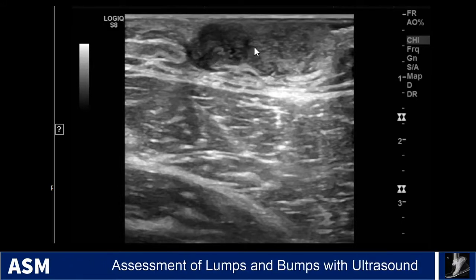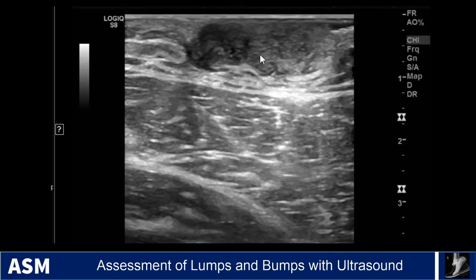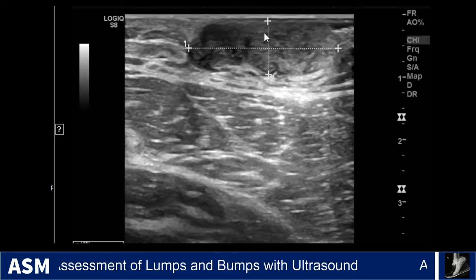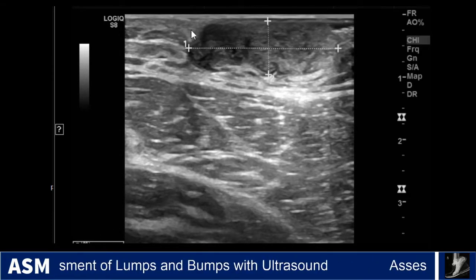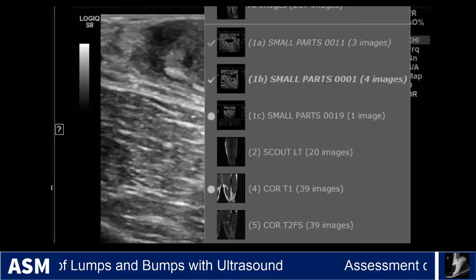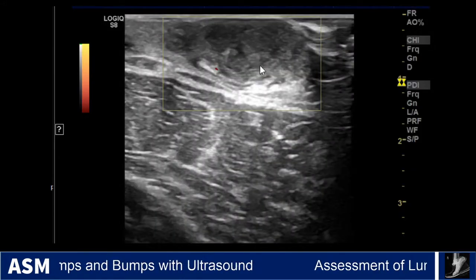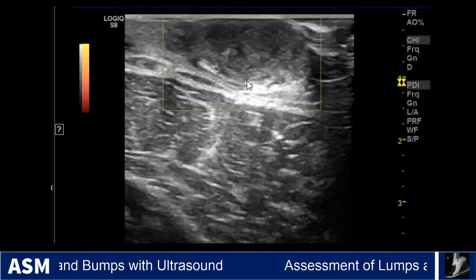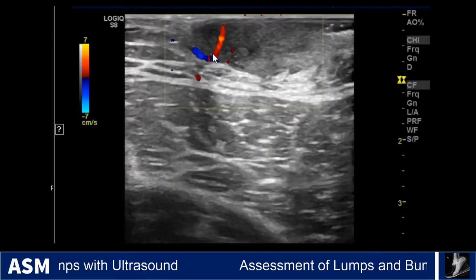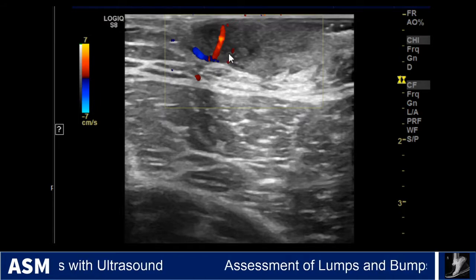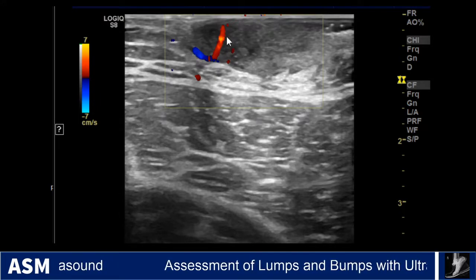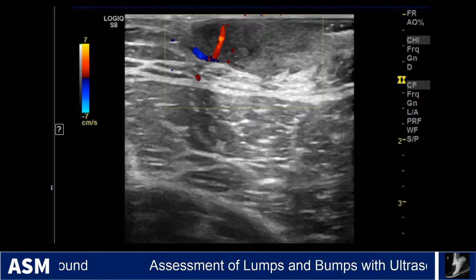There are some hypoechoic areas within the mass, and measuring at least a portion of it at 2.5 cm. Switching to power Doppler, not much flow is seen on this image. With color Doppler on another part of the mass, we see a vessel going right into it with some surrounding blood flow.